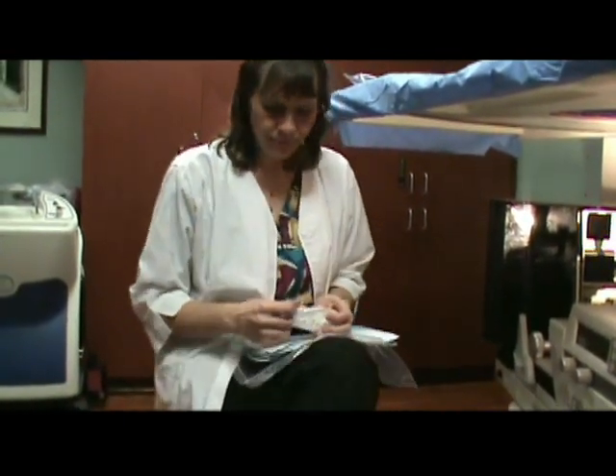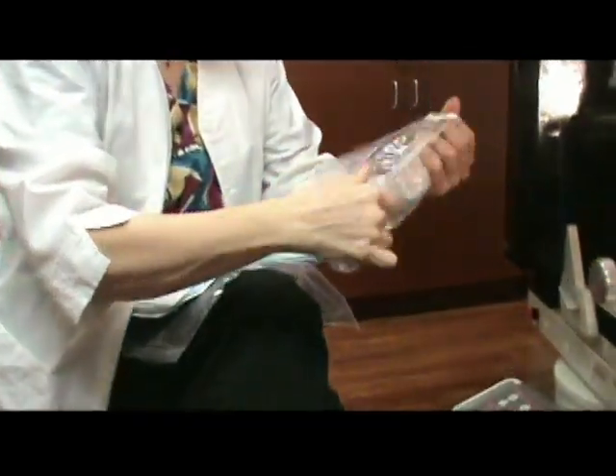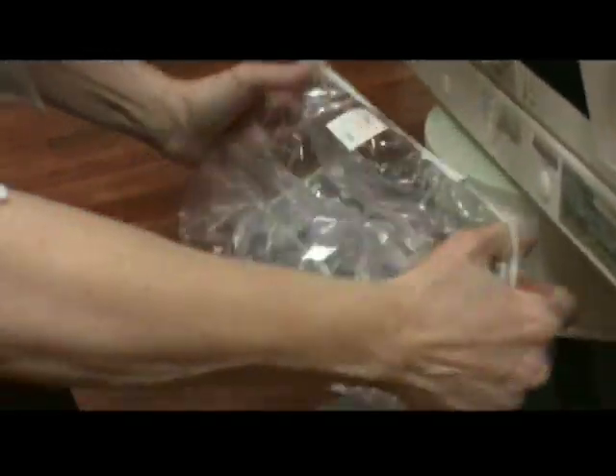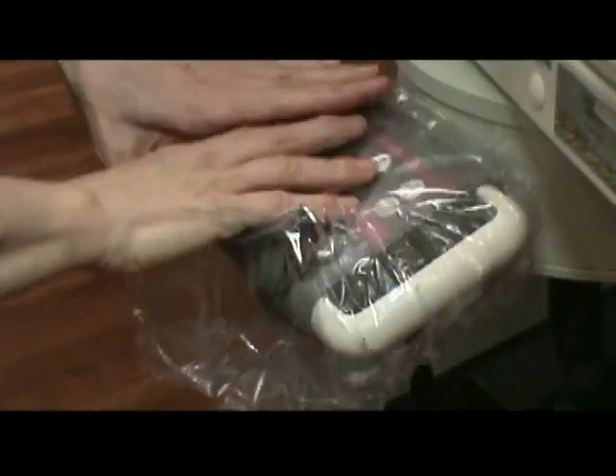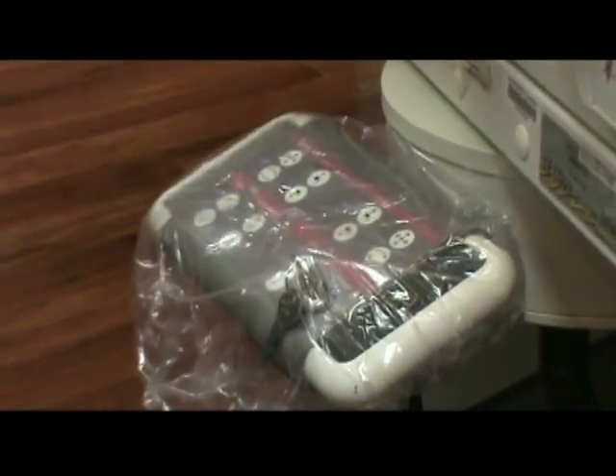The first piece is the module cover. This is like a shower cap and it just goes over the control module, keeping it free of any fluids or anything on your gloves.